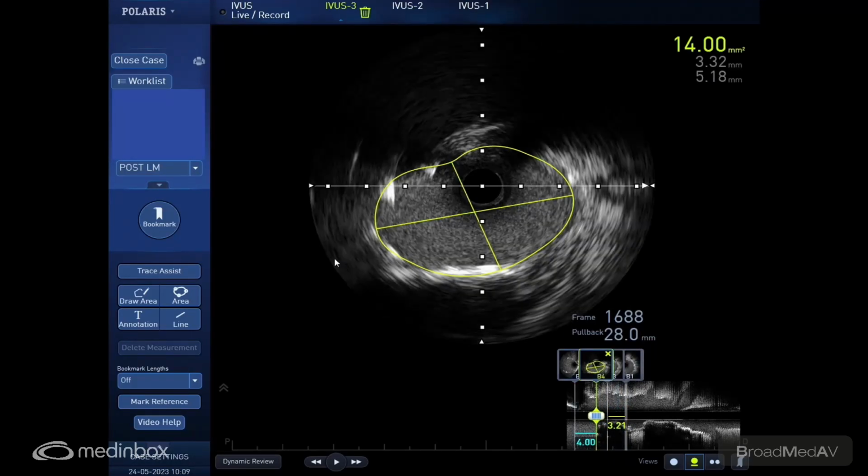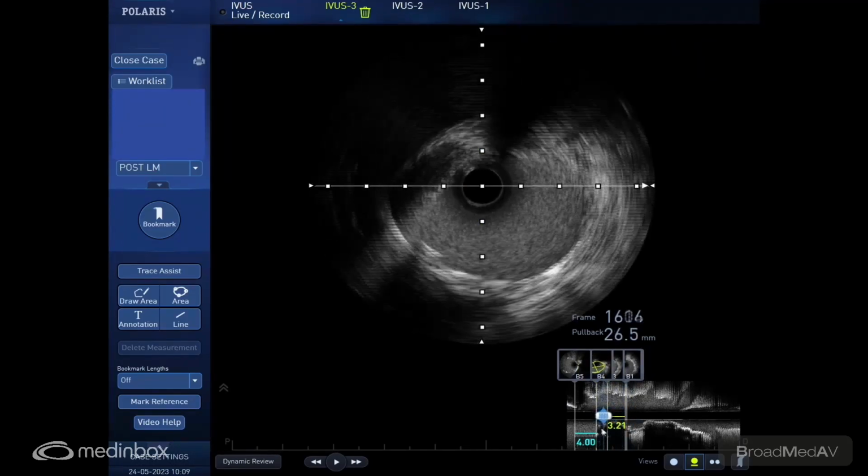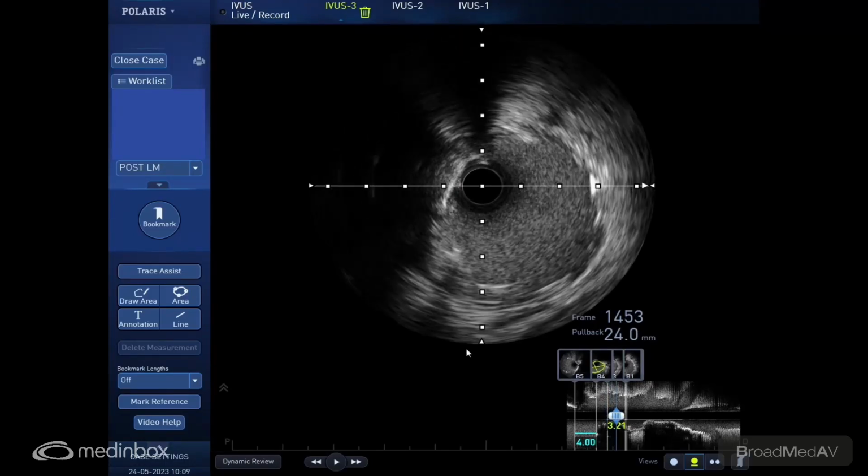Now my issue is whether we should use a... The expansion is good. Only thing is there is a malapposition of 3 millimeter length in the shaft of the left main, which needs to be addressed with a short 5-6 balloon. That balloon has to be placed not at the distal edge, not at the proximal edge, exactly in the middle portion. Okay, let me see how it goes. I'll take that suggestion, but overall, except for that, we wanted 2 millimeters. We've got 4 millimeters for chimney into the aorta.